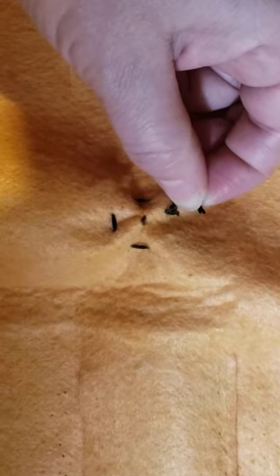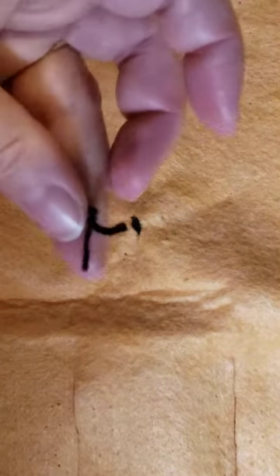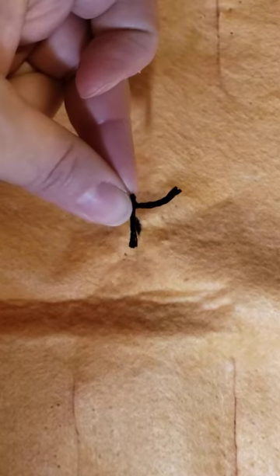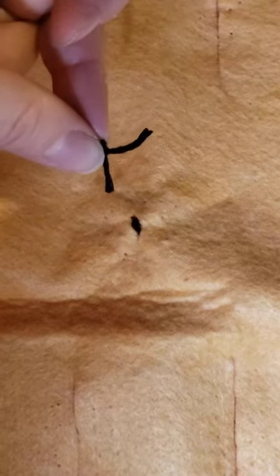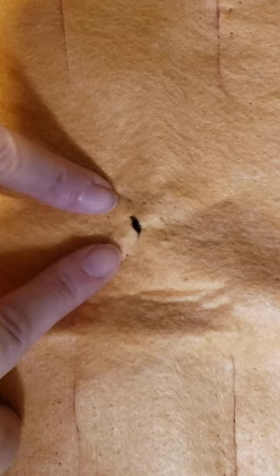And this is how you remove it, actually. You want to make sure that the tags are not too long that they're actually getting into your incision site either. Because in an anal gland removal surgery, if this is what you're going to be using it for, the anal glands are located in these two locations near the rectum. Okay, and there's your purse string suture.